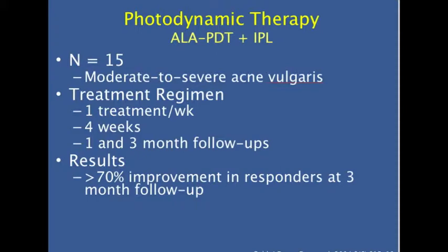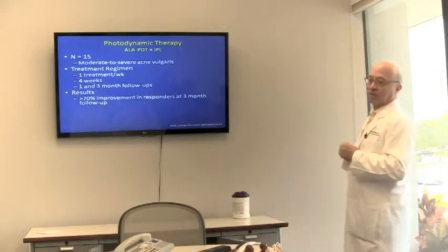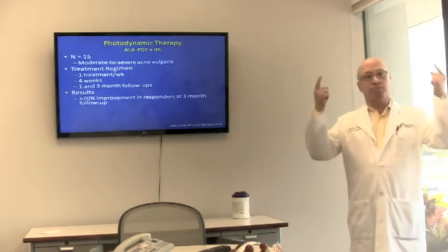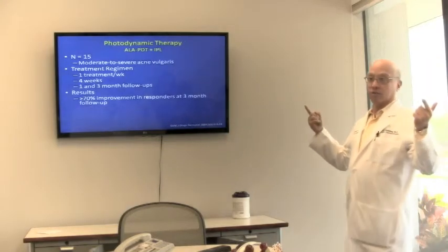This is a study done on IPL, and again, I don't think it matters if it's BBL, IPL, or any of the LEDs, looking at moderate to severe acne, and now we're adding the ALA, the Kerastick, the DUSA product. And he did one treatment a week. In real life, that's not what we do. It's not real practical, because when you start putting on the ALA, remember, they become photosensitive for a little while afterwards.